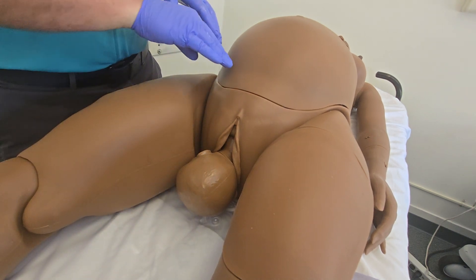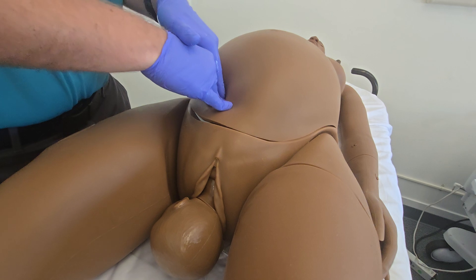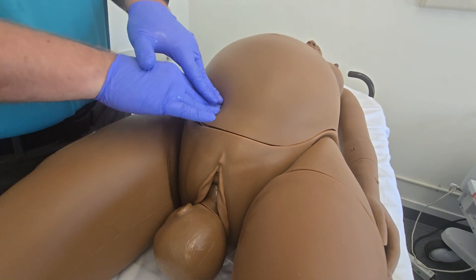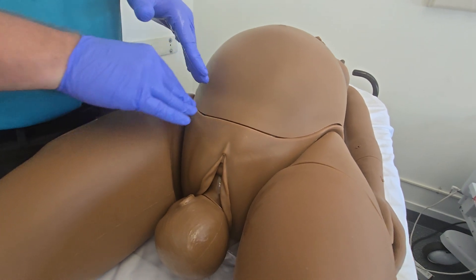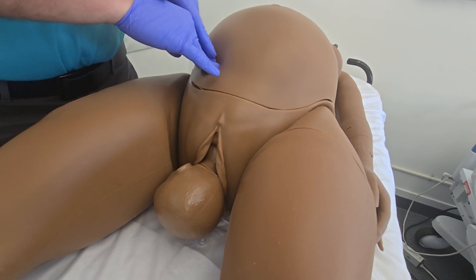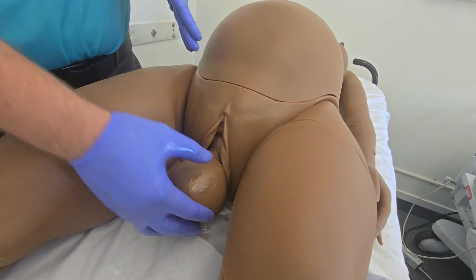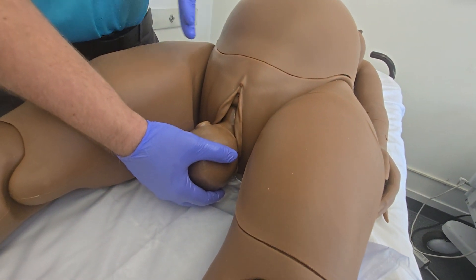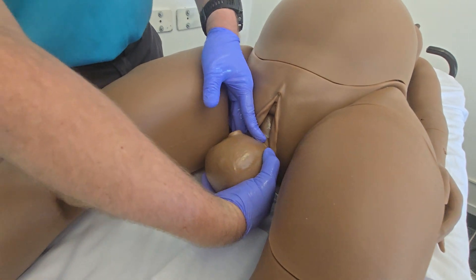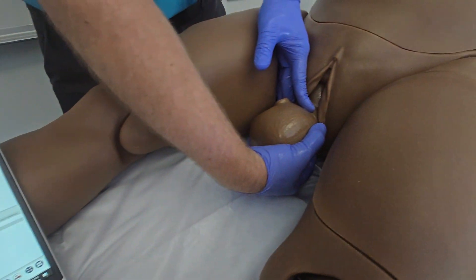What we'll do is apply suprapubic pressure — on the suprapubic pressure sensor on either side. The belly module isn't properly connected, so the suprapubic pressure sensor isn't going to activate or detect that we're applying pressure. We can actually hit resolve shoulder dystocia manually. Once the shoulder dystocia is resolved, the baby is no longer locked and can be delivered.